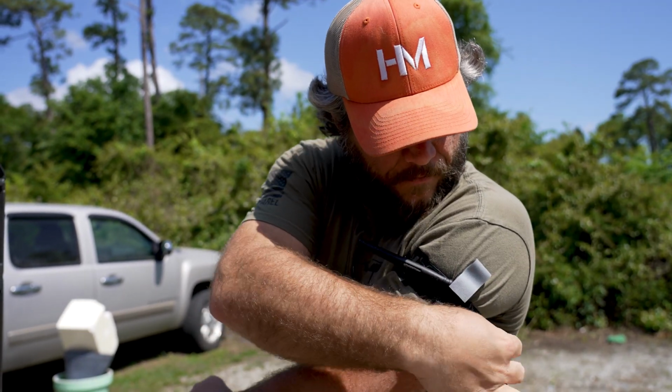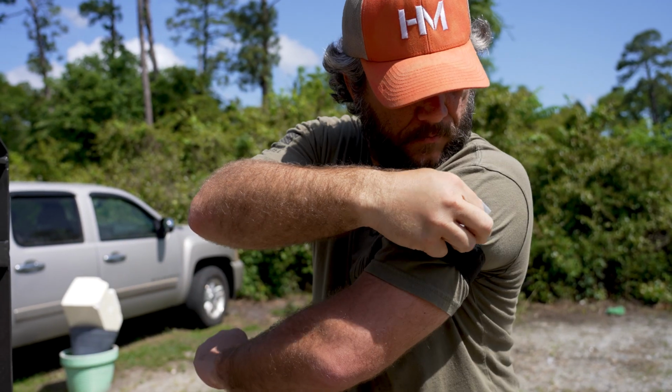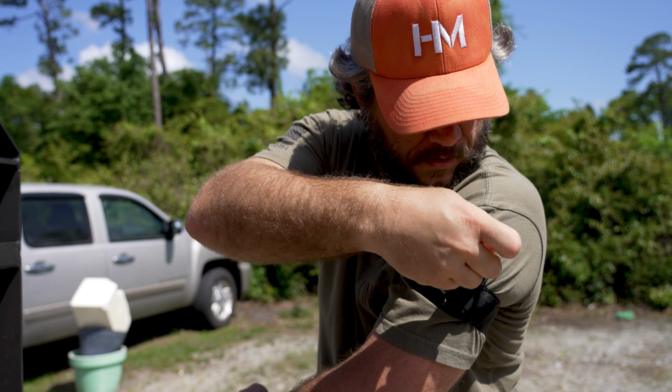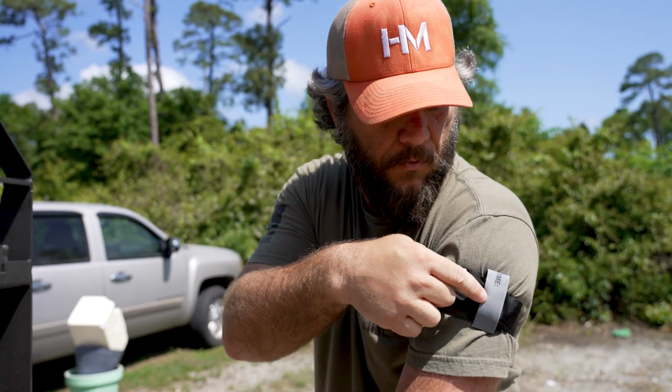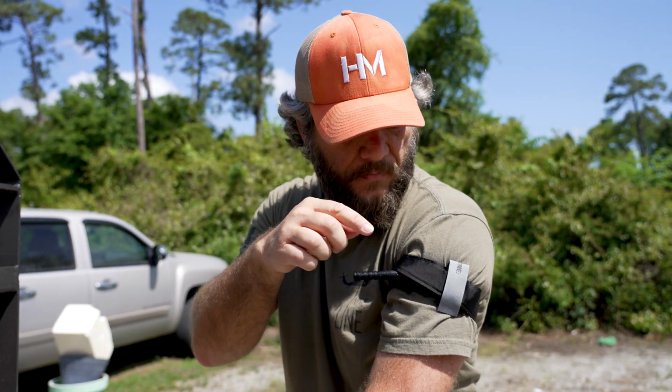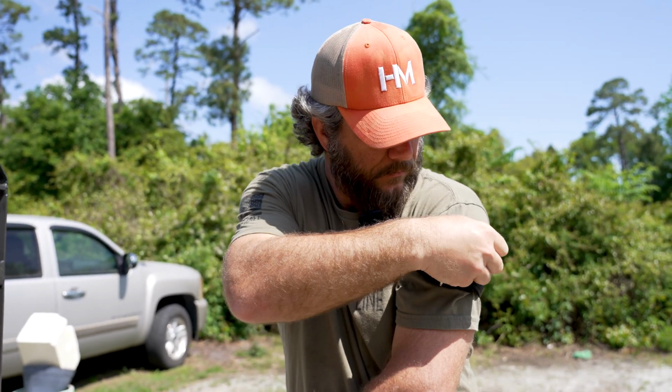That goes right there. Finish wrapping. That's your time strap there. Then what you would want to do is write what time the tourniquet went on, and that way people just kind of have a record. I think people used to think that they could only stay on for a couple hours, but now they can stay on for 24 hours.